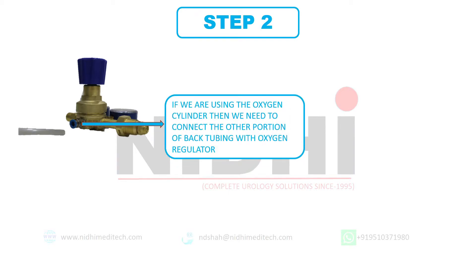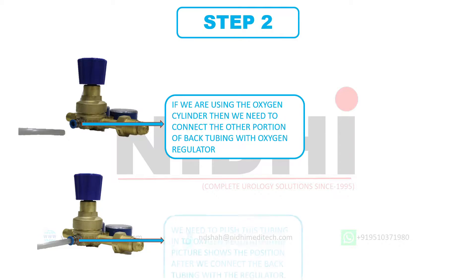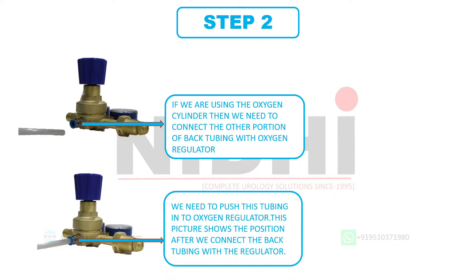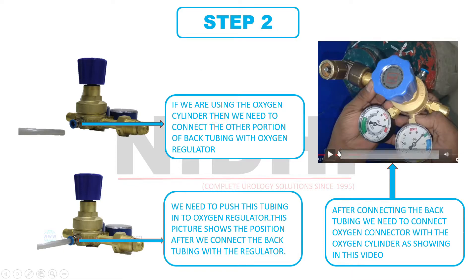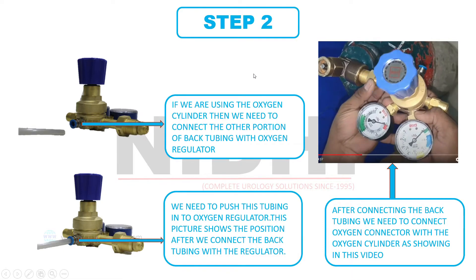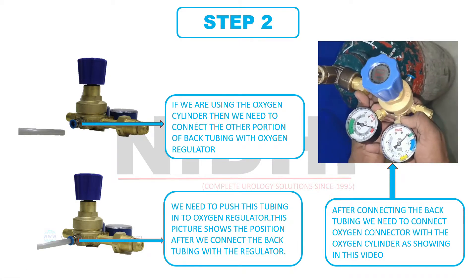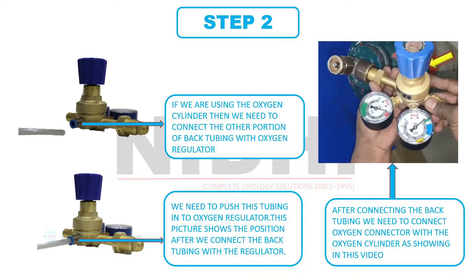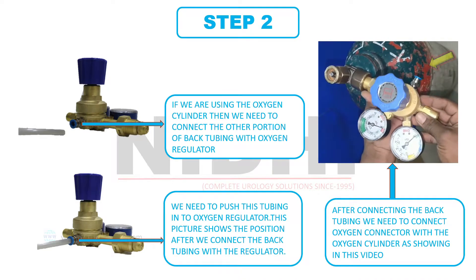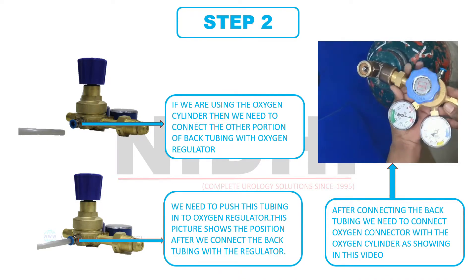If we are using the oxygen cylinder, then we need to connect the other portion of the back tubing with the oxygen regulator. We need to push this tubing into the oxygen regulator. This picture shows the position after we connect the back tubing with the regulator. After the successful connection of tubing and oxygen regulator, now we need to connect the oxygen regulator with the oxygen cylinder, as we can observe in this video. This is the portion where we just connected the back tubing, and this is how we will connect the oxygen regulator with the oxygen cylinder.